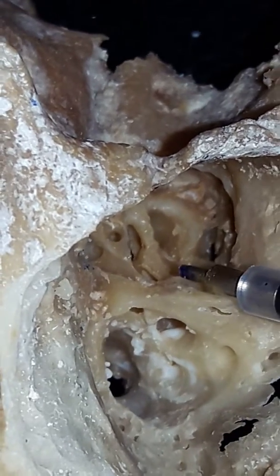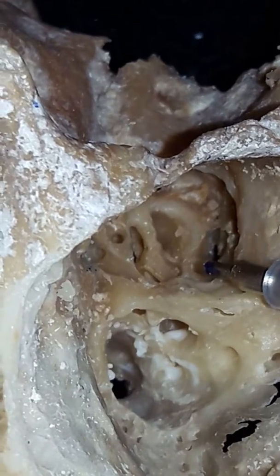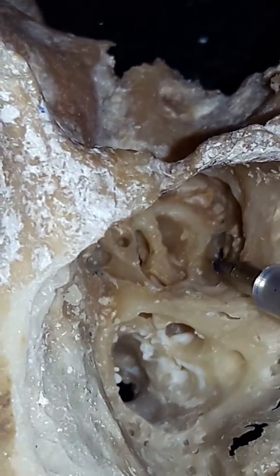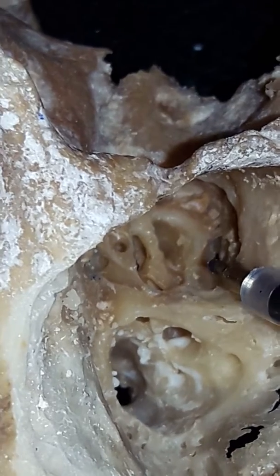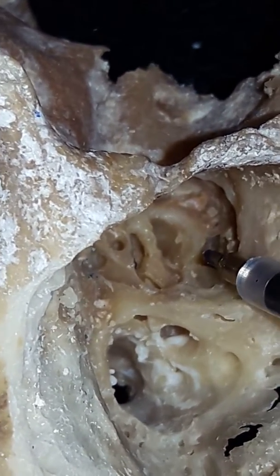The space above this fustis is called the concomerata medialis. The space below this is called the concomerata lateralis. If I drill inferior to this fustis, I reach the subcochlear tunnel. Previous surgeons used to call it hypotympanic cell. So this is a big trap.